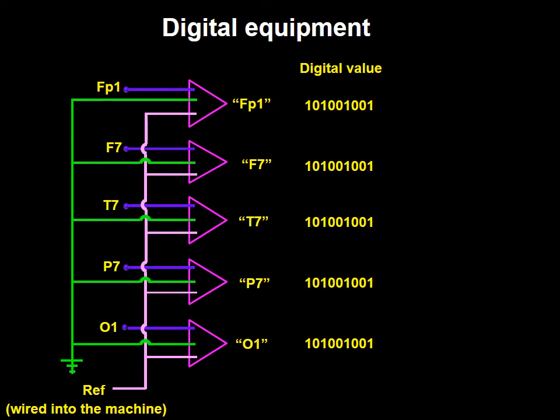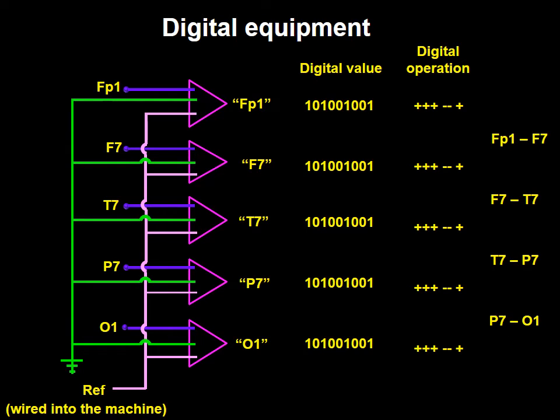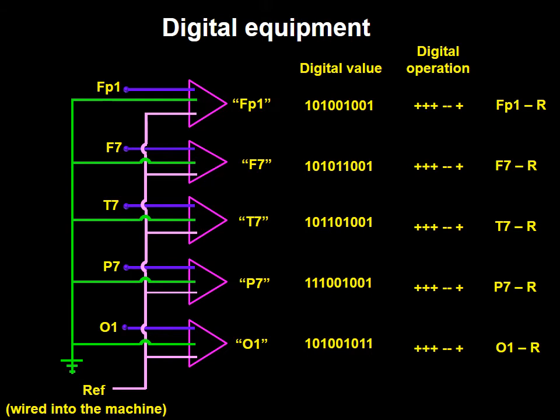The processing will start by giving it a value using the binary numerical system. That binary numerical system is later manipulated and ultimately displayed, in this case as a bipolar recording, or as a referential montage using whatever reference is desired by the reader. Sorry I have taken so long discussing this question, but I think most books on the subject do not cover it, and I wanted you to have an operational understanding of the subject.